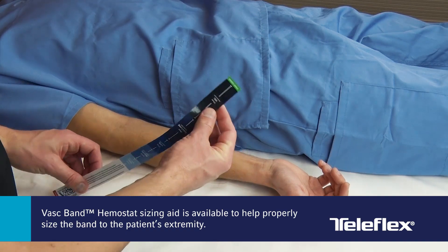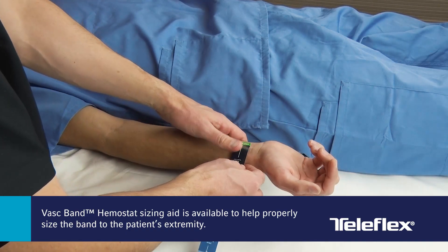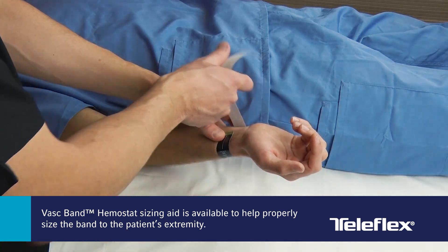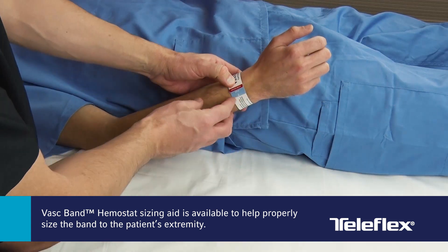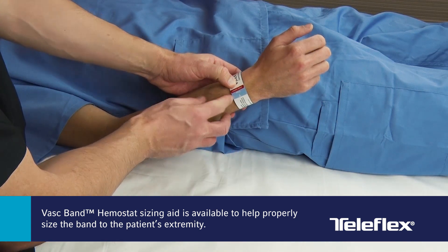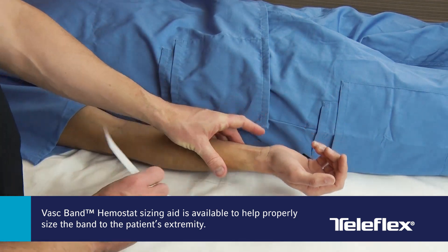It is important to properly size the band to the patient's extremity. Five sizes are available to accommodate different patient types. If needed, a sizing aid is available from Teleflex that wraps around the patient's extremity to determine the optimal size VASC-Band Hemostat.